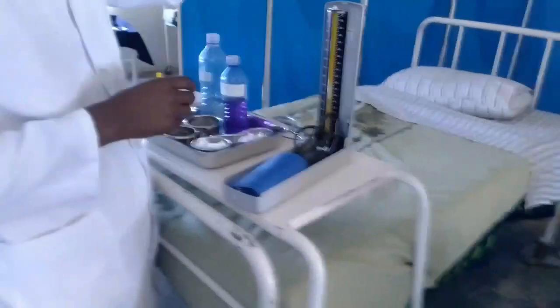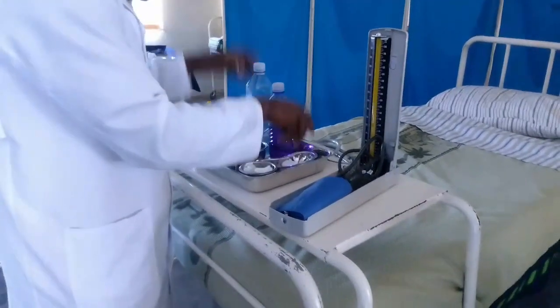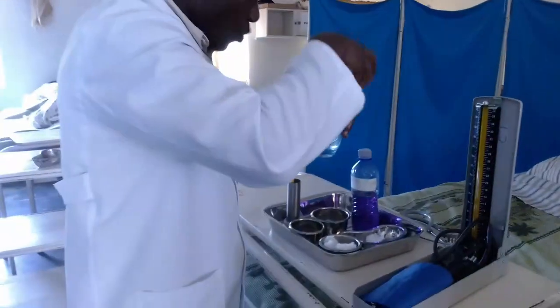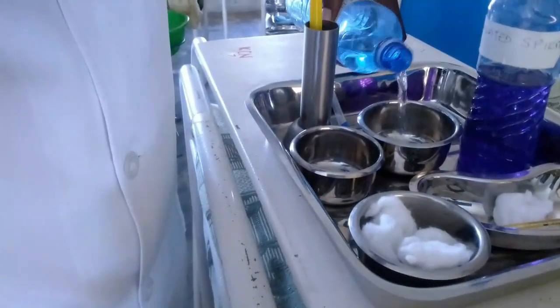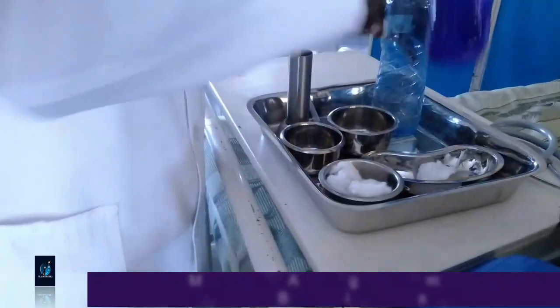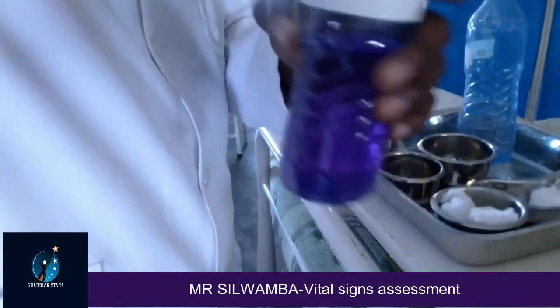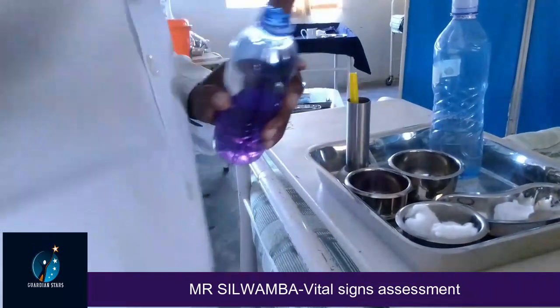Then before use of this thermometer, you're supposed to get cool boiled water. You put it in that galley pot, just a little. Okay, this is cool boiled water. Then you get methylated spirit, which is here. Methylated spirit. You put it in that galley pot.